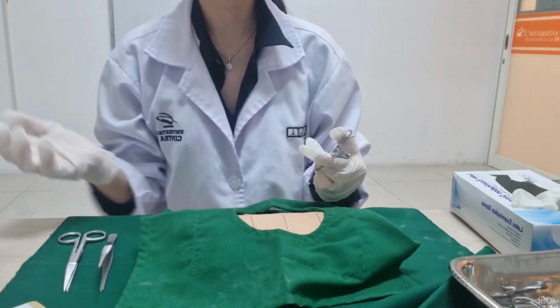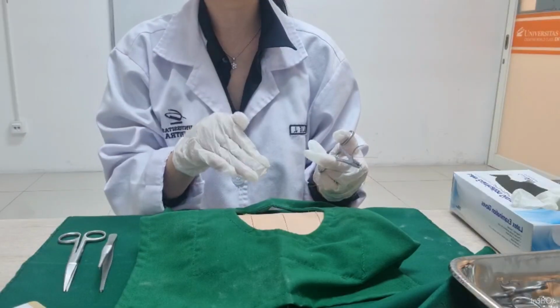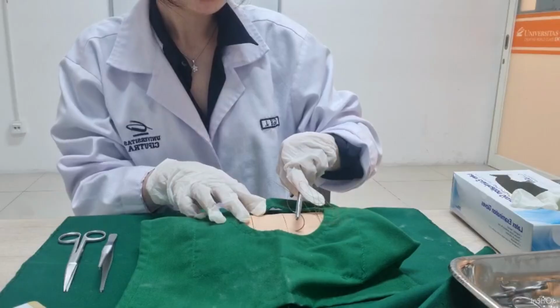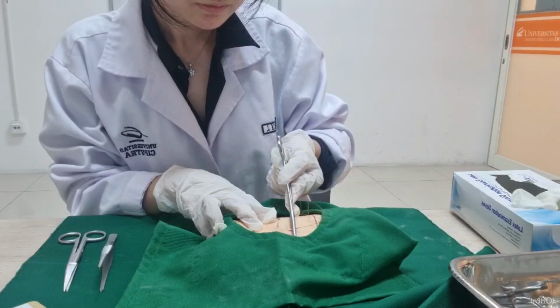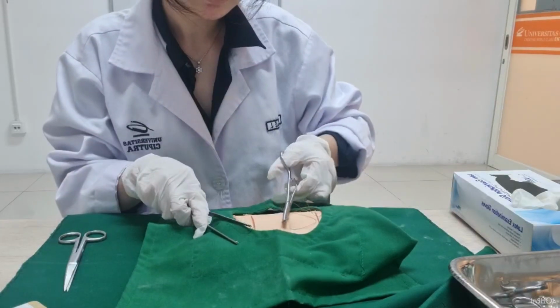And it should be noted that the size of the skin and the subcutaneous tissue sutured on both sides of the wound must be the same for both edges of the wound to approach the right position, in the position opening outwards. Okay, so I will start now.